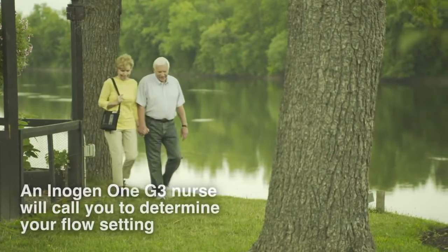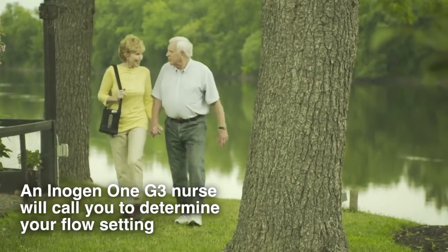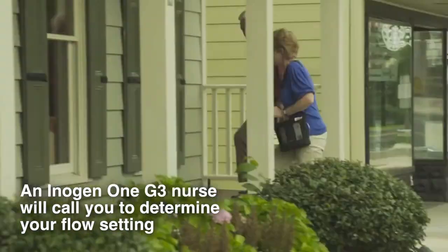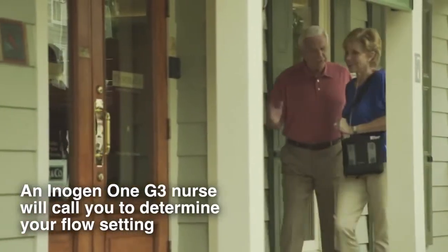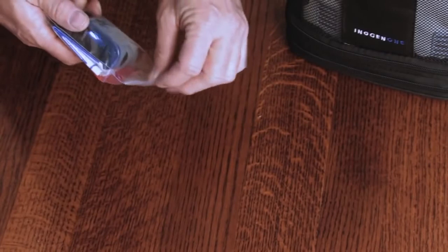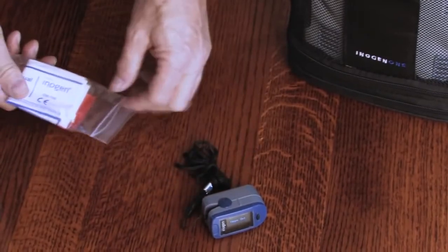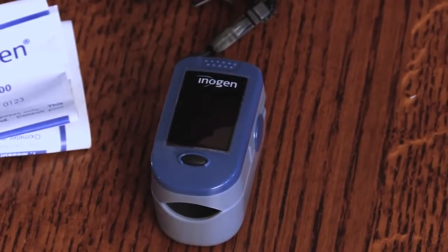An Inogen staff nurse or respiratory therapist will call you to test your oxygen levels on the Inogen One G3 to determine what flow setting you should be using based on your doctor's guidance. The fingertip pulse oximeter in the paperwork bag is used for this test. The pulse oximeter is not covered by Medicare or insurance and needs to be returned with your paperwork.